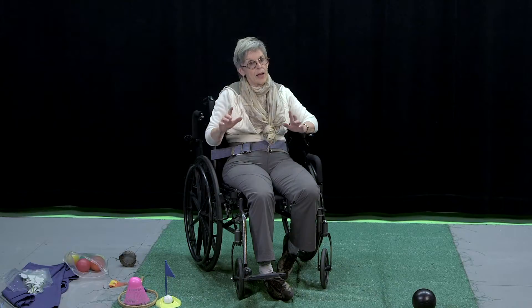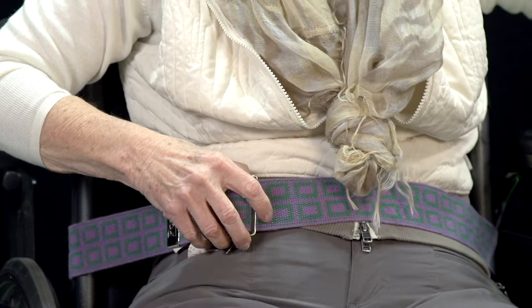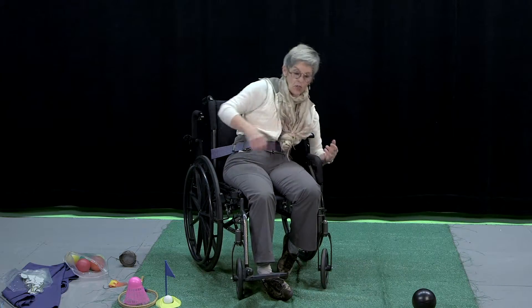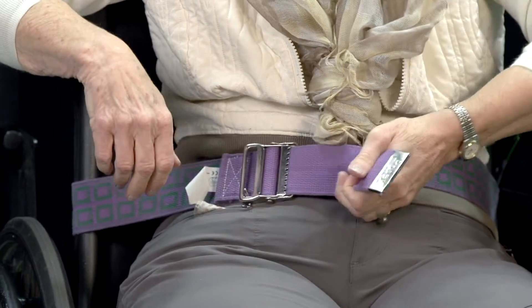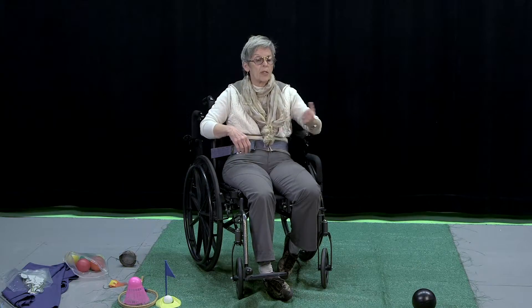The other thing I want to make sure you know to do — and this is not considered a restraint because I can self-release this — I've taken what's called a gait belt and wrapped it around the outside of the chair, because this is my weak side and if I don't protect my weak side, I'm going to fall and won't have the strength to push myself back up. It's not a restraint when I can physically move it myself, which is a big issue in nursing homes.